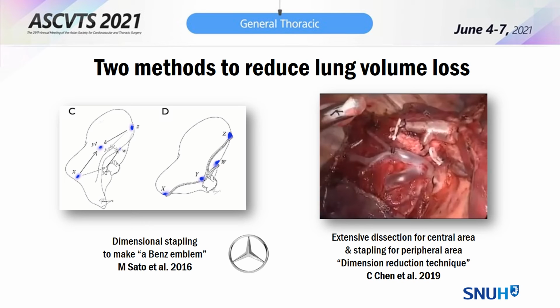Currently, my practice is using the stapler. In the initial phase of segmentectomy in the mid-2000s, I used electrocautery. However, because of a high rate of persistent air leakage, I abandoned electrocautery. I am now using the stapler exclusively.